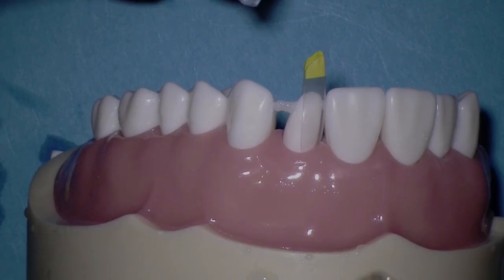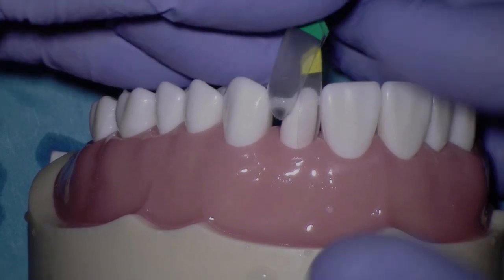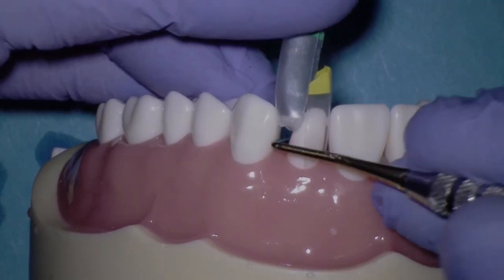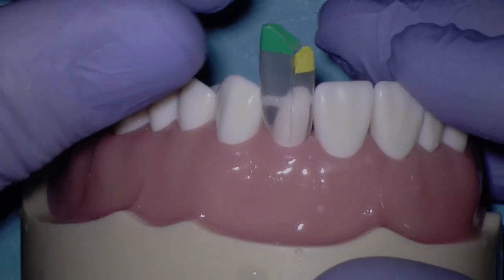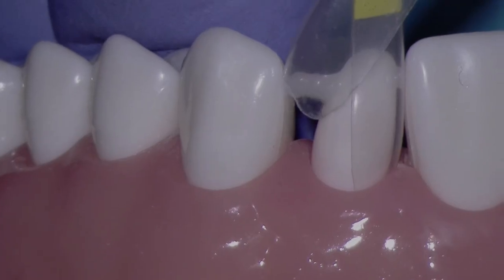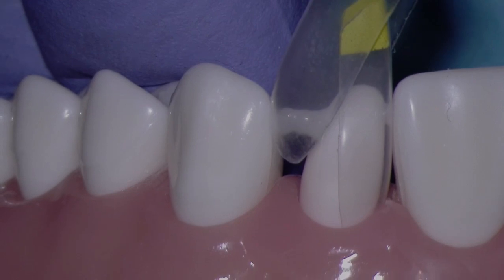Now we're ready to go ahead and bring in our large green BT matrix on the distal. So, just like on the mesial, we're going to bring the matrix in at about 45 degrees to the embrasure. We'll use the straight end of the Clark Explorer to pry the teeth apart, and the matrix should go in nicely. Let's try that one more time. Remember, you bring it in at about 45 degrees.